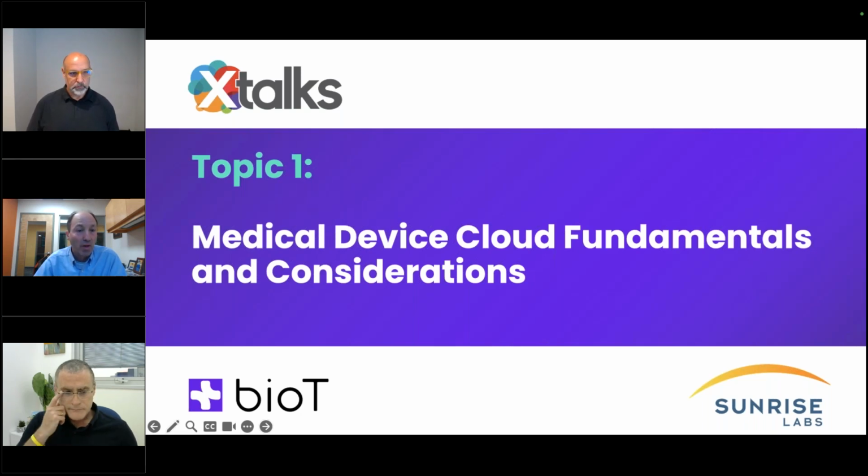For example, if you have a mobile device that's not plugged into the wall or connected on Wi-Fi, you might want to do data compression by, for example, doing signal or image processing on the device and then sending up features or an answer. And it depends very much on what the device does. Again, the clinicians want answers very quickly. So if you delay by a second by having connectivity, that's a problem sometimes. And sometimes it doesn't matter at all. So it very much depends on architecting it in a way that the application is optimized.